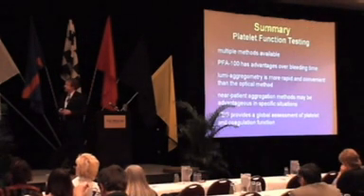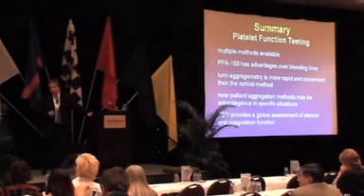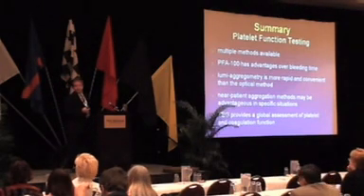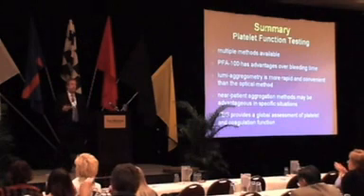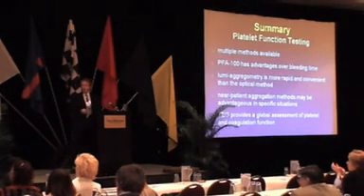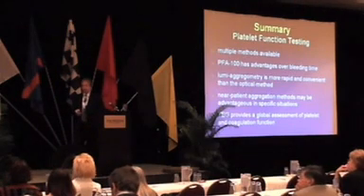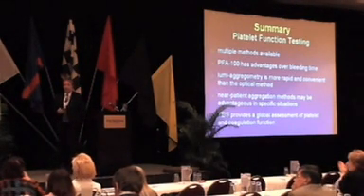So to summarize platelet function testing, we have a lot of different ways to measure platelet function. They don't all work the same way. They don't always correlate with each other. We have multiple methods. The bleeding time is definitely outmoded. I think we're all agreed with that. The PFA 100 is certainly more suitable as a routine clinical test, and it's probably the only one we have right now that is suitable for use in that regard, in my opinion.